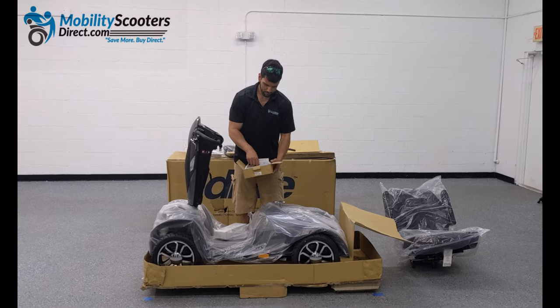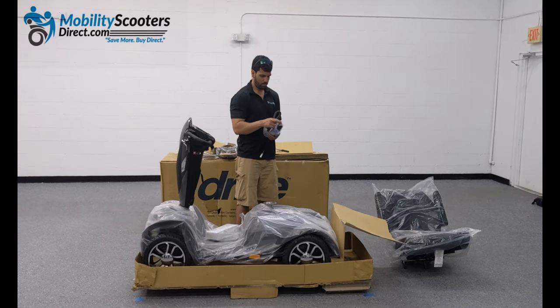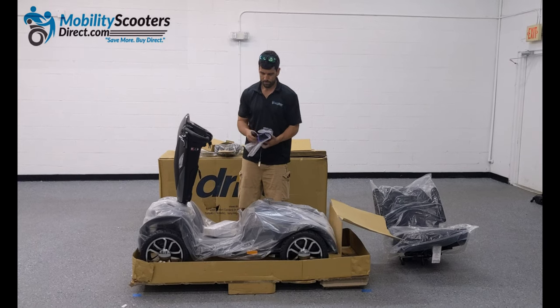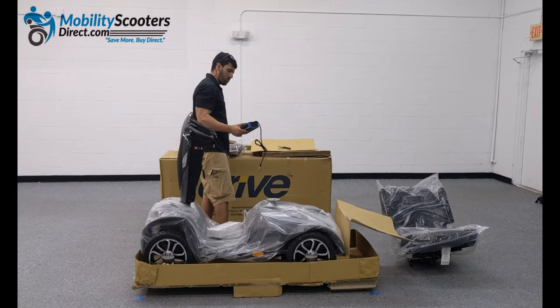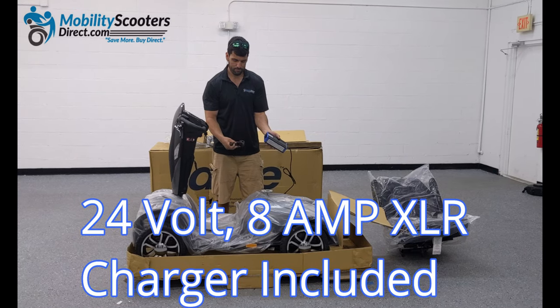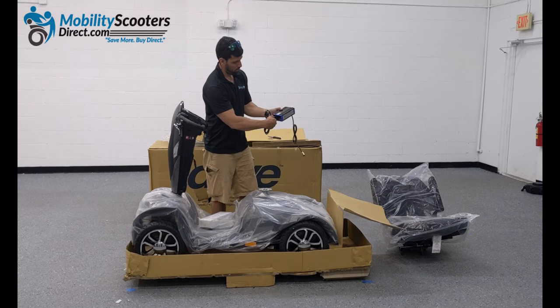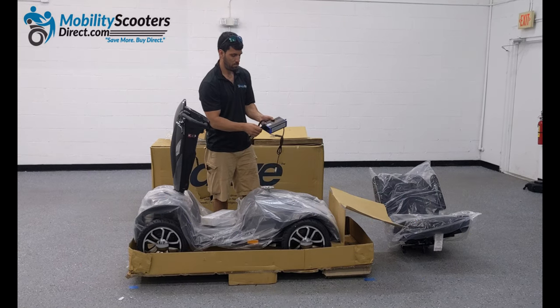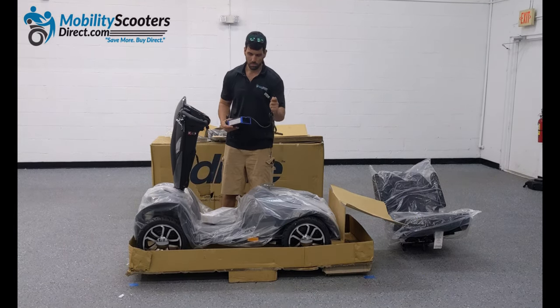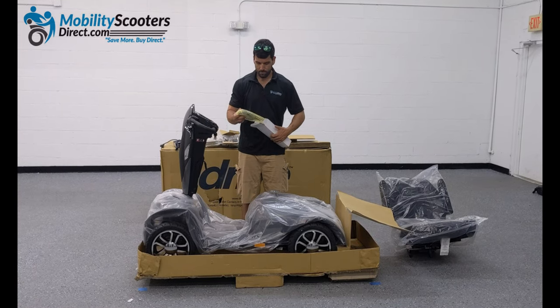Inside the small brown box you'll find the charger. You'll need to connect the batteries first, but once you do so you will want to charge your unit overnight. The charger that comes with the unit is a 24 volt 8 amp XLR charger. Simply plug the cable into the wall to the square part of the charger, and the other end right into the scooter to the left side of the tiller, which we'll show you shortly.